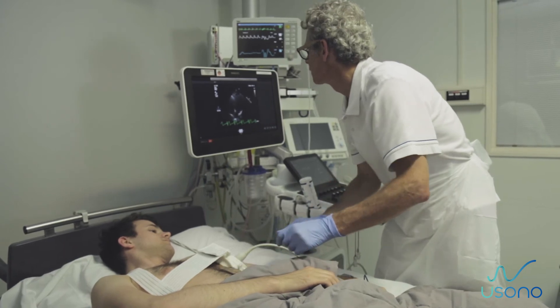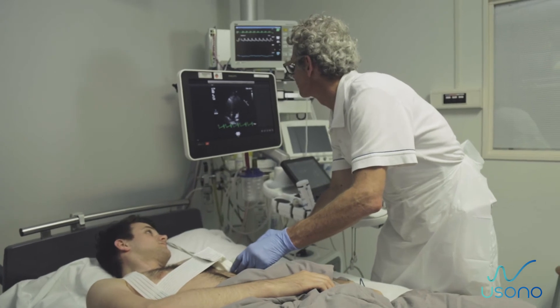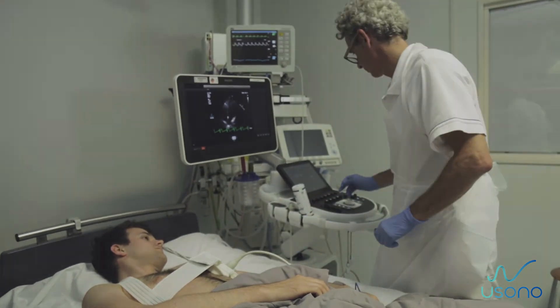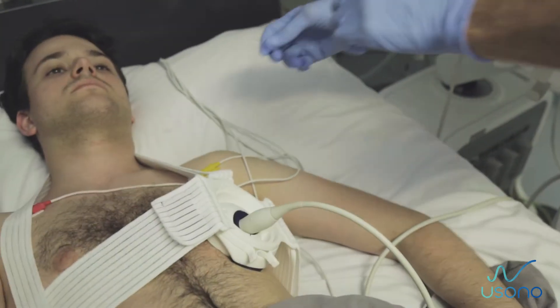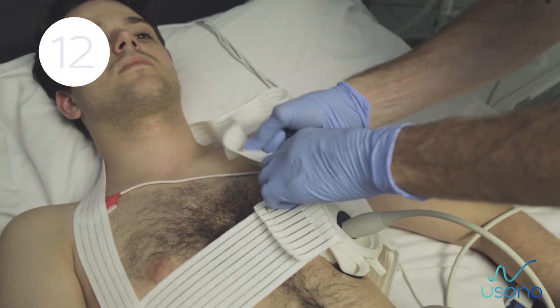Ready to use: Once the system is in place, the probe can be rotated to get additional views from different angles. When the desired view is determined, the practitioner can release the probe without losing the image.